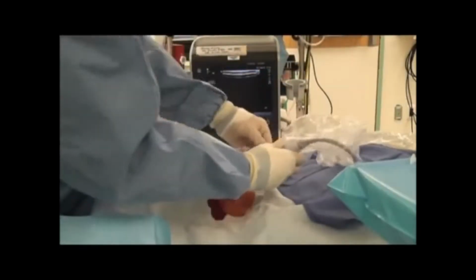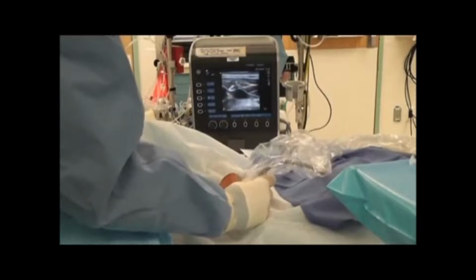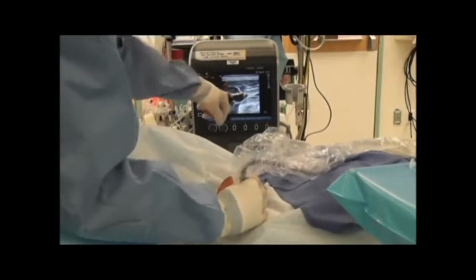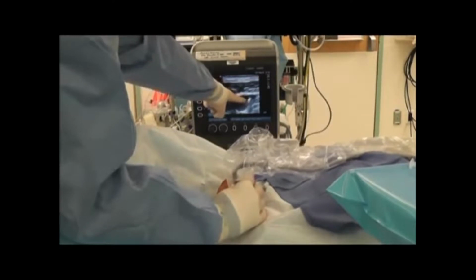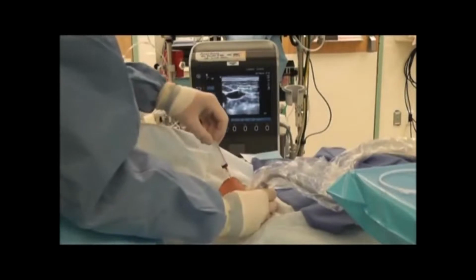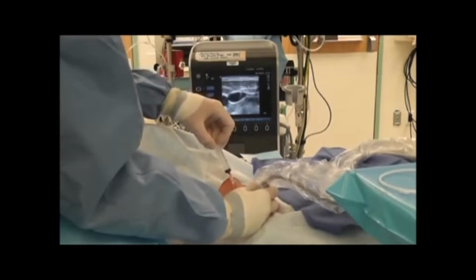And you should examine by tilting the probe all the way and following the wire inside the vein and into the innominate vein. So tilting to see distal, and then you see the wire, and tilting some more and see the wire going inside the chest. Tilting some more and more. In this case, it was incomplete, and probably someday I'll upload a better video so you can see the whole path.